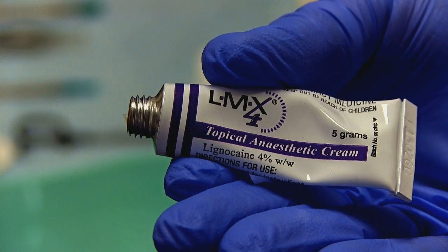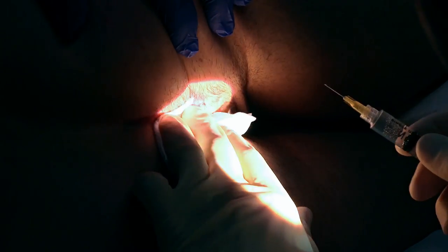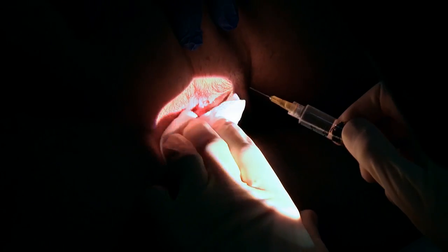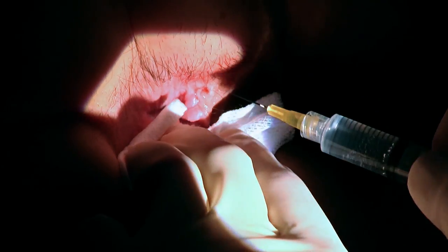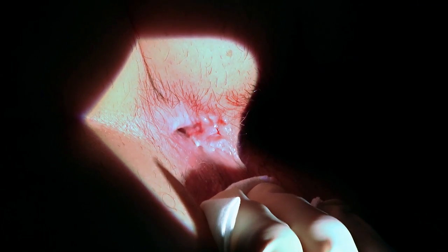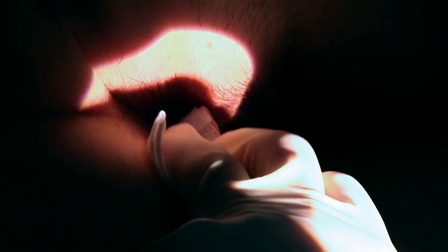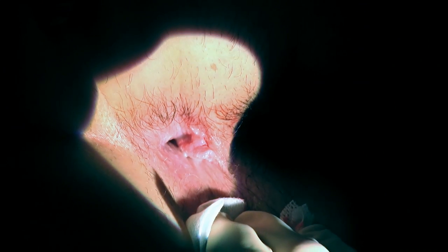We're going to grab hold of your right buttock — you'll feel me just touching the surface of the skin, removing some of the gel. You will feel a slight pressure but it shouldn't feel quite as sore as before. A little bit of local anesthetic going in just now — well done, that's it, you're over the worst. The great advantage of using adrenaline in this mix is there's hardly any bleeding at all, but it does cause the skin to change colour and become more pale. That's why it's very important to be clear where you're going to do your biopsy before you insert the local anesthesia.